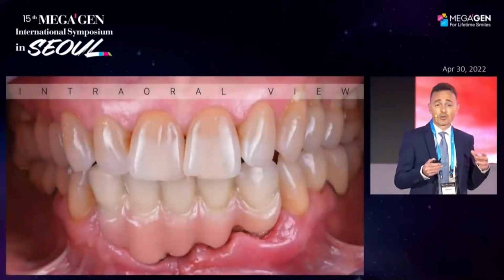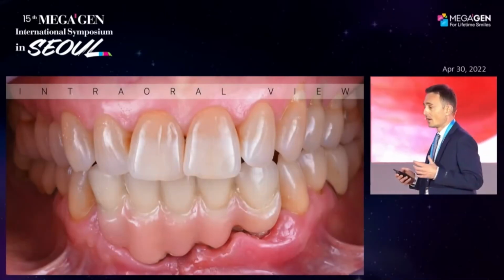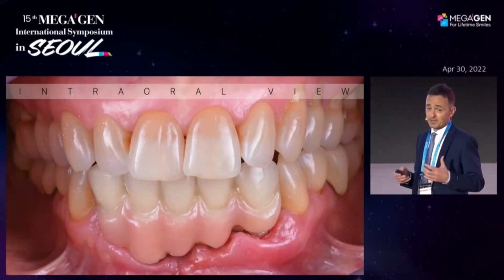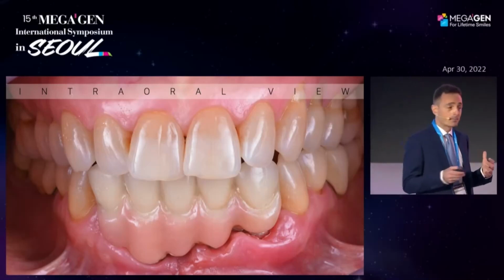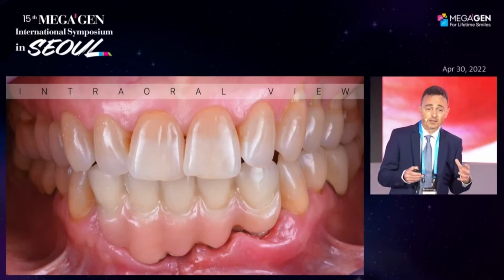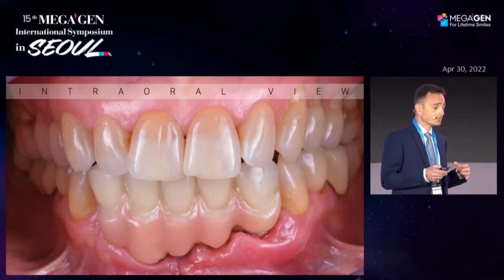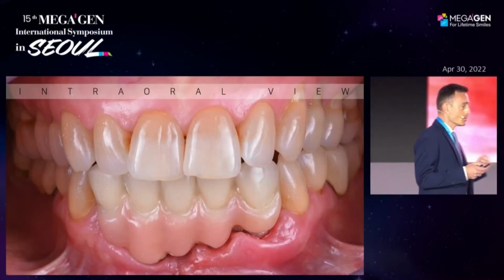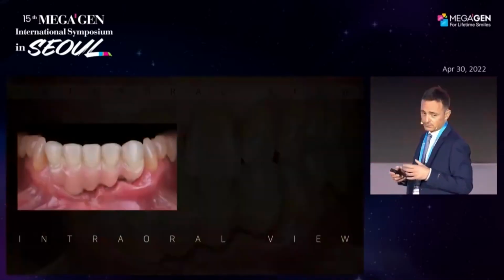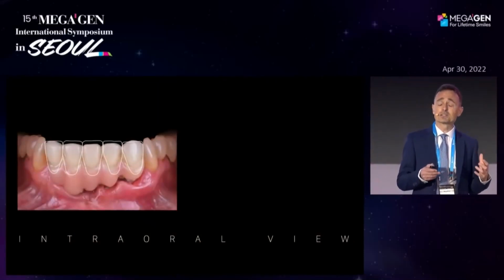And observing the intraoral point of view, the initial clinical situation, what we can see is that everything is in order. Everything seems to be fine, but the patient came to my dental office complaining of bleeding in the lower part where we can find this little mini Toronto bridge. And she told me that every time she was trying to wash this part of the mouth, it was also painful.